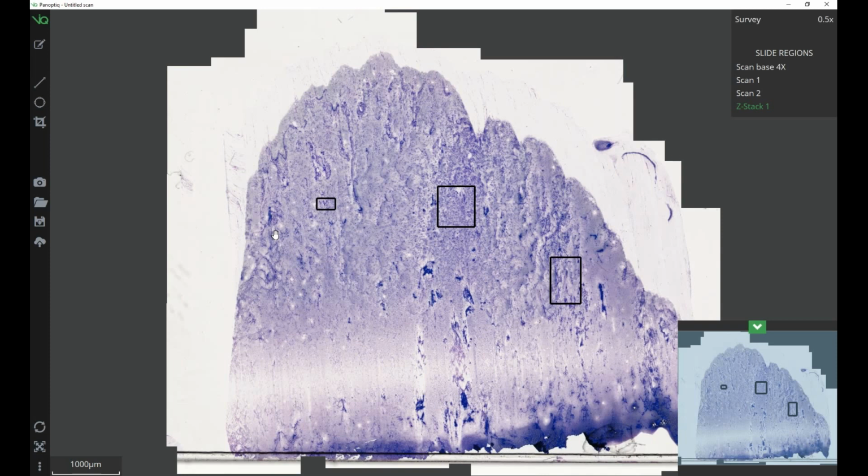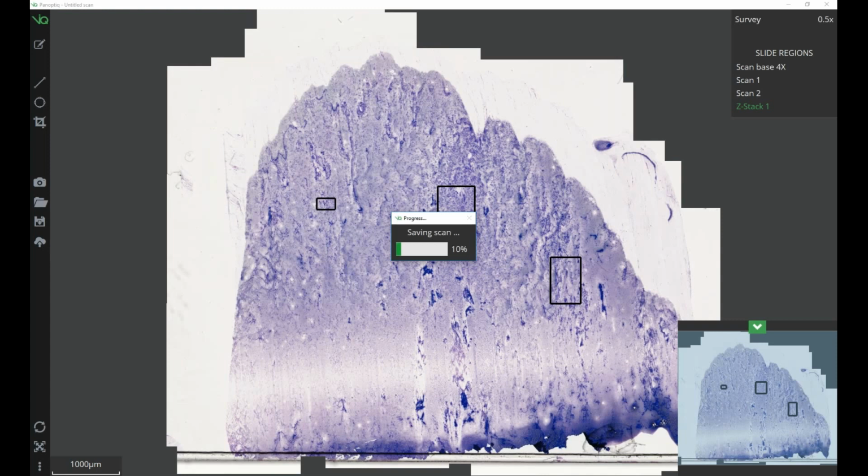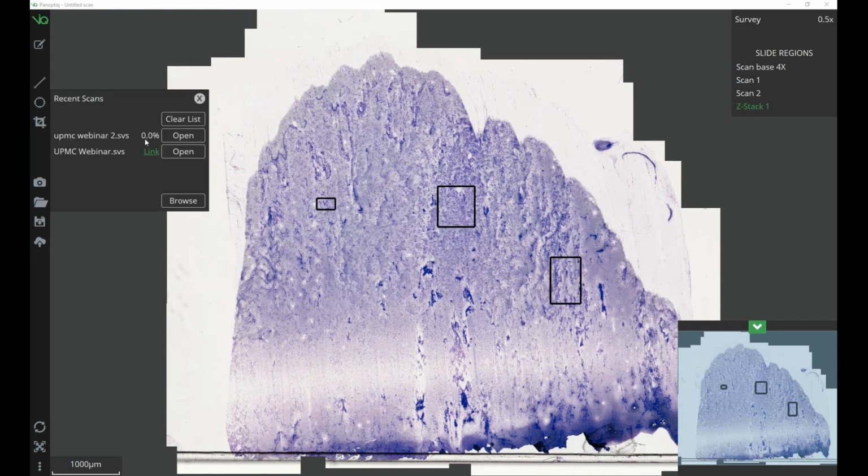Although this wouldn't necessarily have to be done, another benefit of the system in a live consult, to bring out the hybrid qualities of Panoptiq, is that you have the ability to keep the scan as a saved image. So using the portal, we can upload a case to our cloud server that will begin uploading essentially right away.